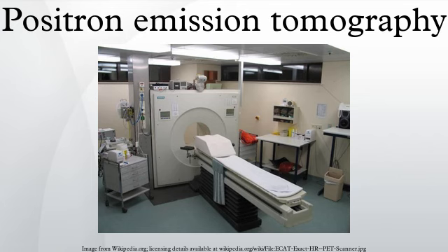Work by Gordon Brownell, Charles Burnham and their associates at the Massachusetts General Hospital beginning in the 1950s contributed significantly to the development of PET technology and included the first demonstration of annihilation radiation for medical imaging. Their innovations, including the use of light pipes and volumetric analysis, have been important in the deployment of PET imaging.